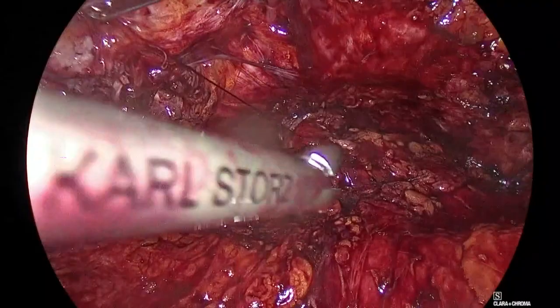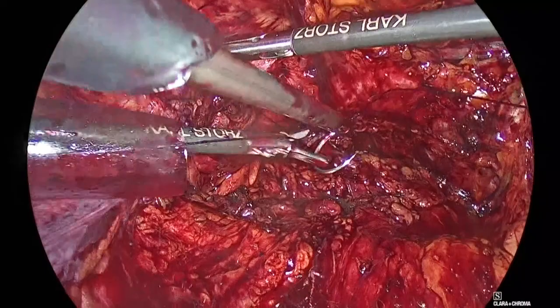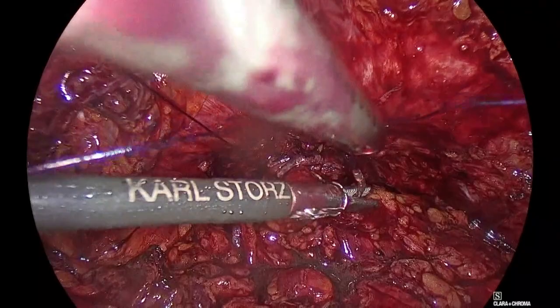Needle, Padeli. Where's the needle? Show me up, here, okay. The tampon is used only for the two initial sutures. That's it. Now we don't need it anymore. These posterior sutures are so important to secure the posterior urethra in place.